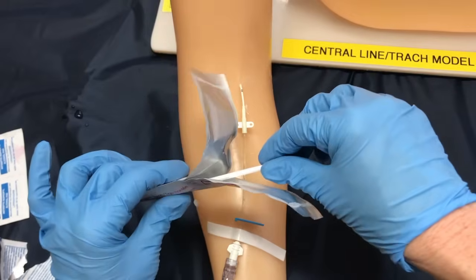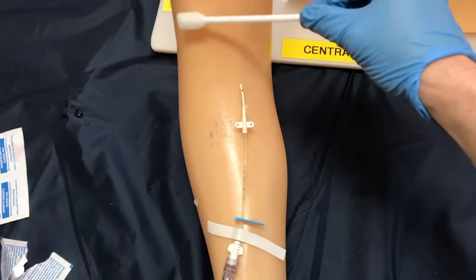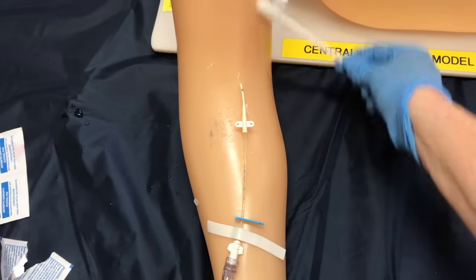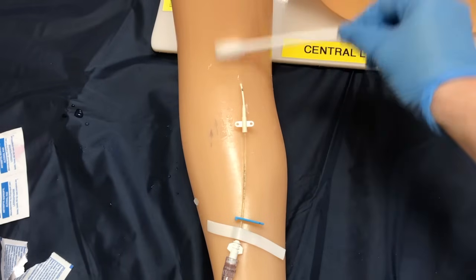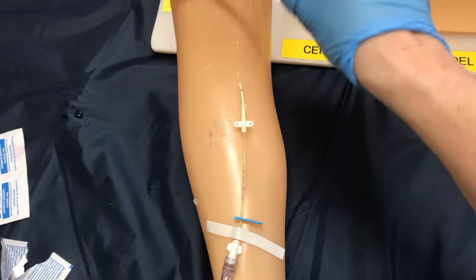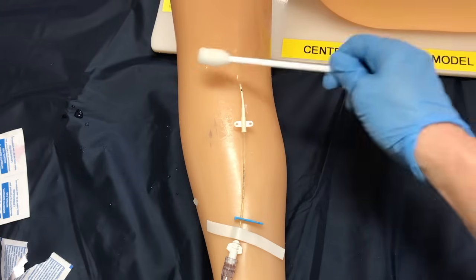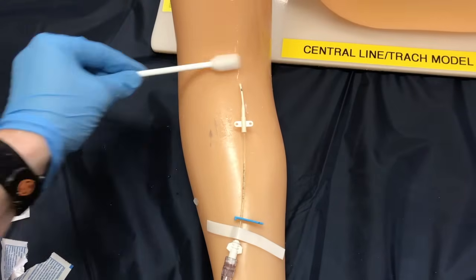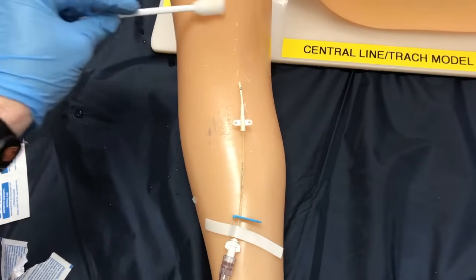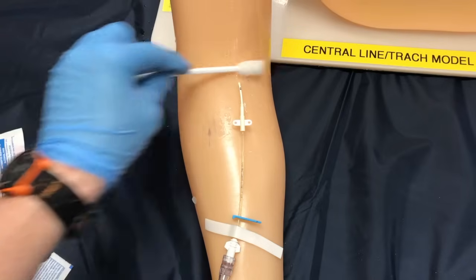I'm going to grab my first chlorhexidine swab — this is the tip I want to keep away from my clean gloves. We're going to start with broad strokes up and down, back and forth — make this nice and wide because my dressing is large, and the friction is just as important as the motion. Fifteen seconds, then we're going to flip the sponge over and go in a back-and-forth motion for another fifteen seconds with nice broad strokes. We want to make sure the friction and the chlorhexidine is getting on our patient's skin. This one is used just for the upper half of the arm.